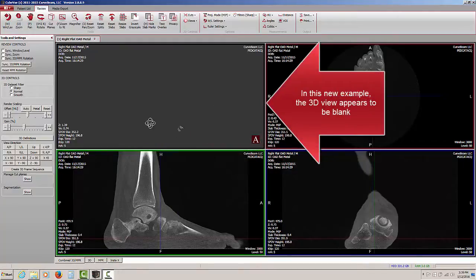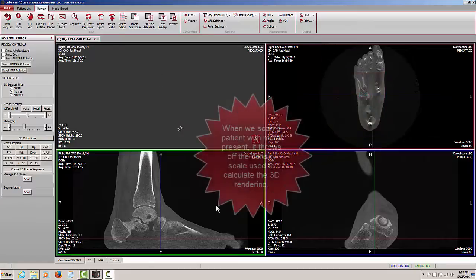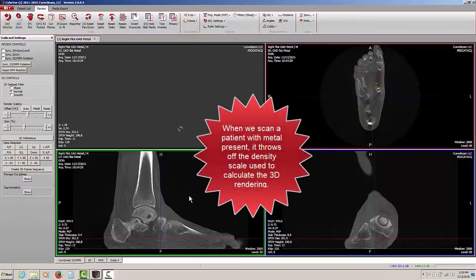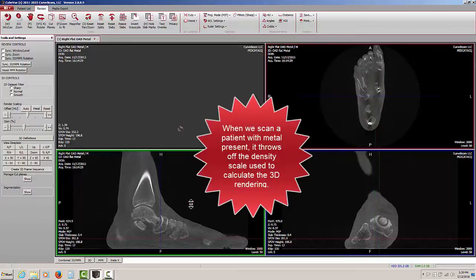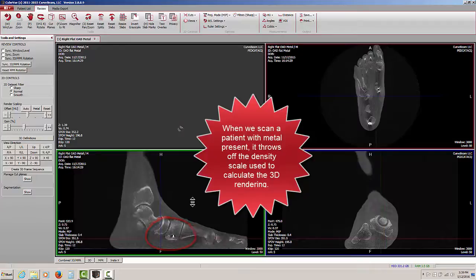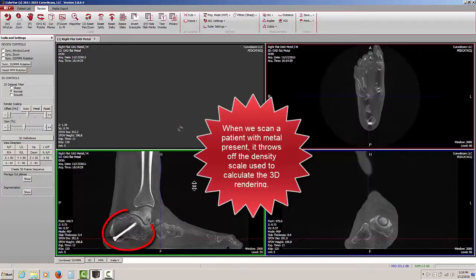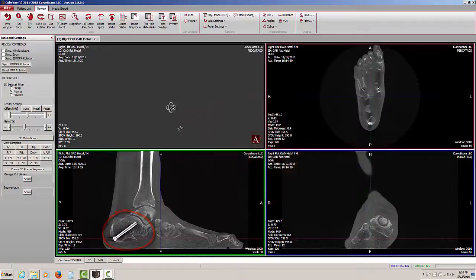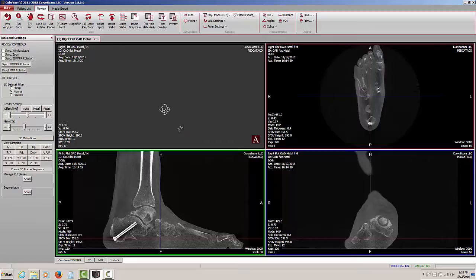In this new case I've just opened, we're looking in the upper left window for that 3D rendering, and we basically don't see anything. That's because whenever we scan a patient when there's metal present, in this case we have metal staples and a couple of metal screws in the calcaneus which we can barely make out, the presence of metal throws off the 3D rendering scaling a bit, so we have to make some adjustments to it.